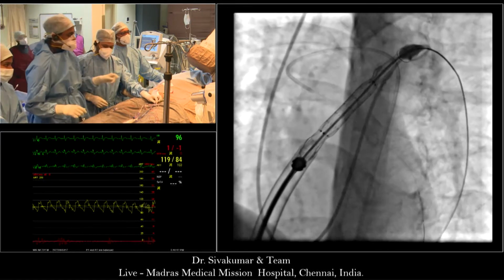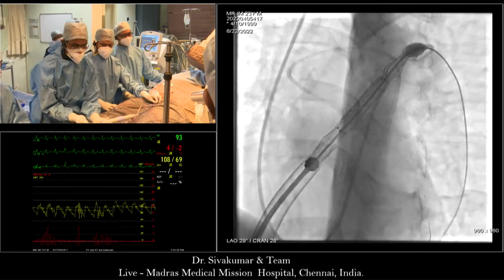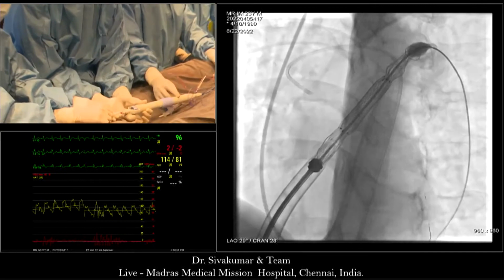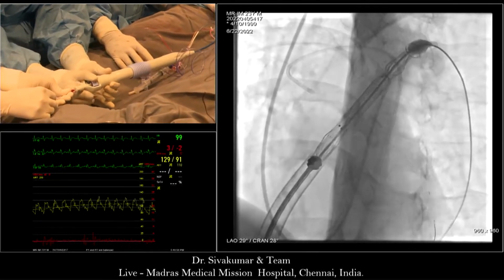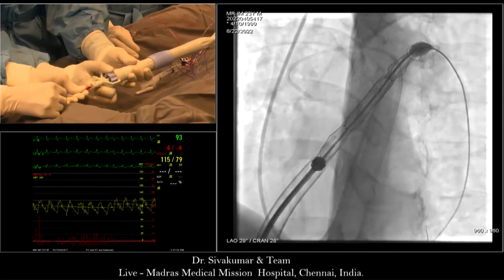Okay. So now I will get it a little bit deeper, and I will start opening the valve. Just hold it here. I have with me Jack Lips from Netherlands, who is the venous technical expert, and he has come to help us with the loading of the valve.